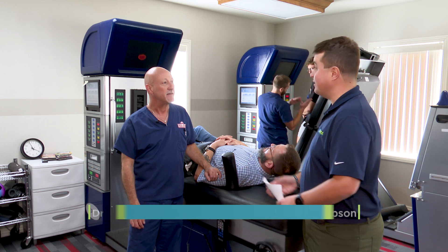We're back on location today here at Cherry Hill Center with Dr. Lloyd. Thanks for having us back today. So we're going to be talking today about something called spinal decompression, and I'm very excited to be able to learn about this because it's actually giving people a lot of relief.